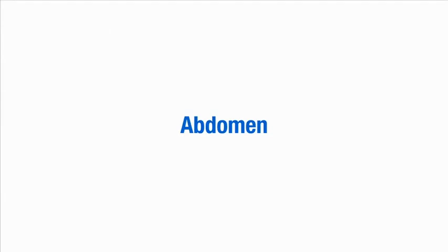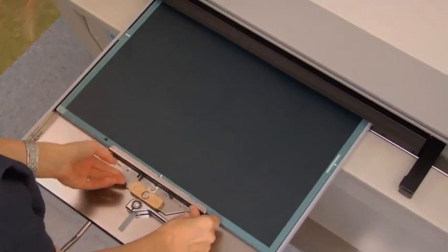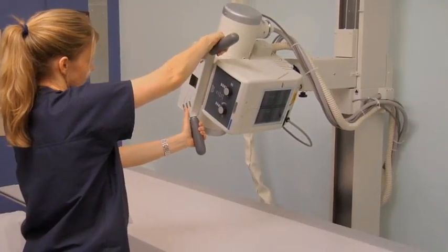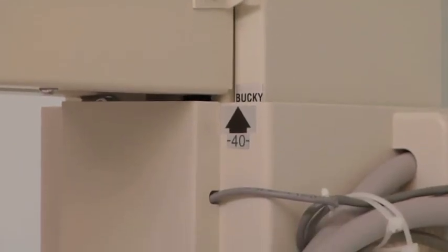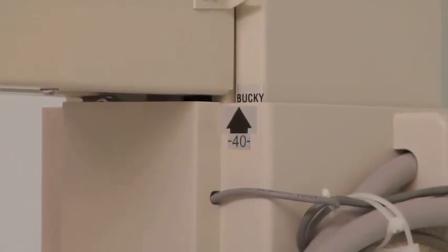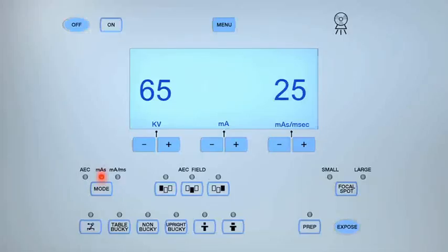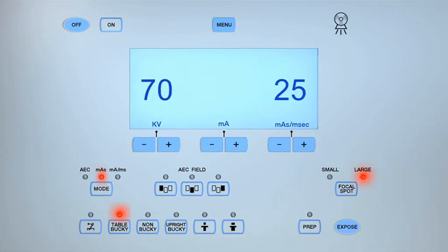To obtain an AP supine projection of the abdomen, begin by selecting a 14 by 17 inch cassette and orientate it lengthwise in the table bucky. Align the central ray perpendicular to the image receptor. Set the source to image receptor distance, or SID, to 40 inches. Move the x-ray tube longitudinally to the end of the table so the patient does not bump their head on it. Select the table bucky setting and the large focal spot on the control panel. Set the exposure parameters to between 65 and 75 kV and 25 to 32 milliampere seconds, or MAS.